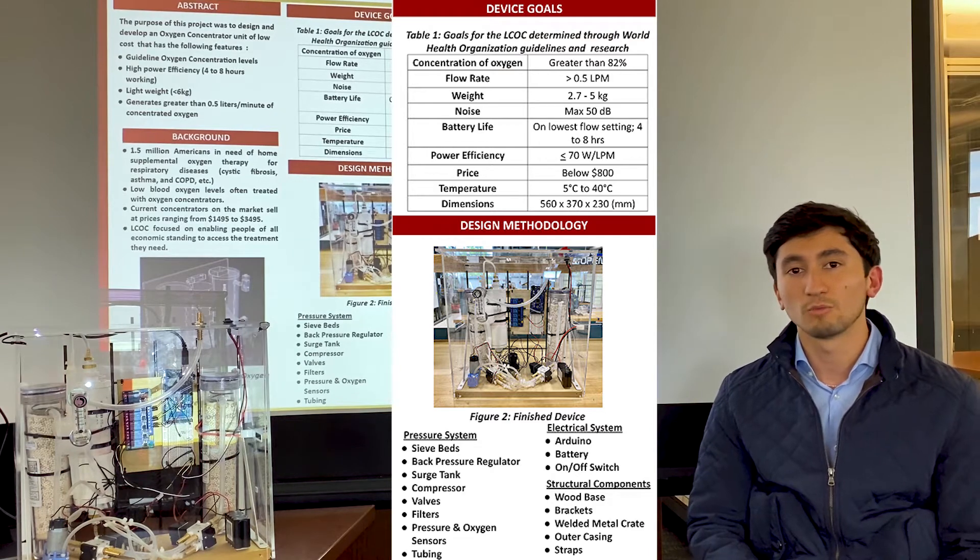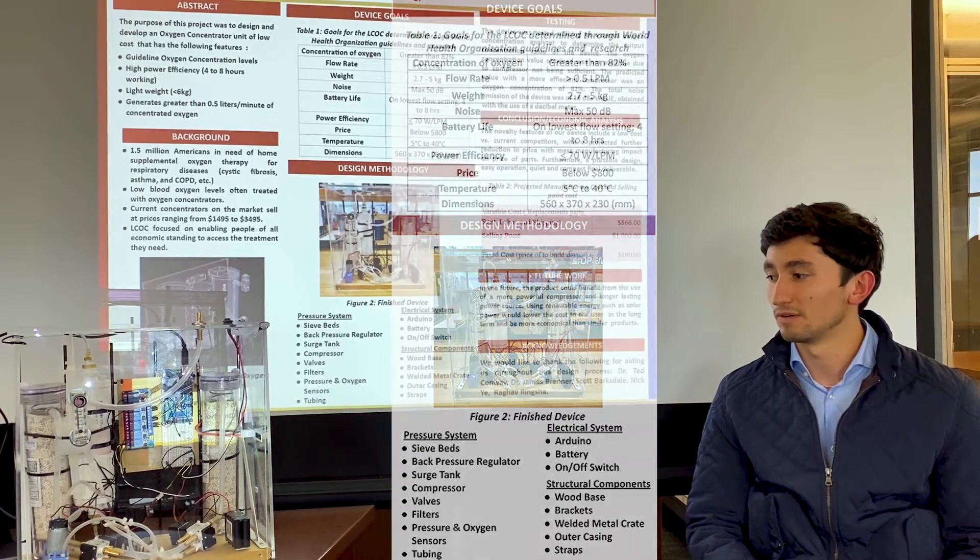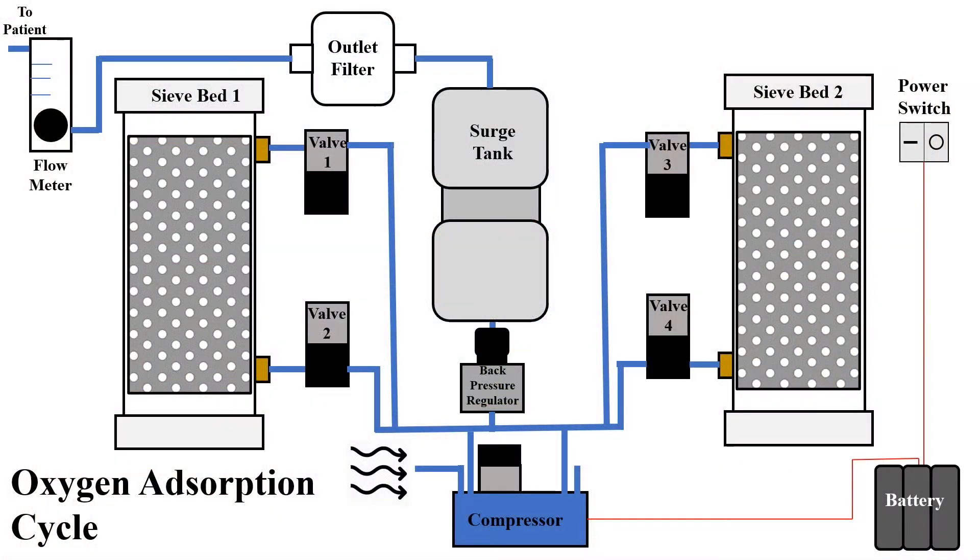We're using a dual head compressor to facilitate the pressure vacuum system required for our device. When the user powers on the device, the battery activates the compressor to begin the first cycle. Ambient air is brought into the compressor through the first valve and then through sieve bed one to have the nitrogen absorbed into the zeolite. From there, the concentrated air is pushed out through the second valve into the back pressure regulator and then through the surge tank. From the surge tank, it's pushed through an outlet filter, through the flow meter, and finally out to the patient.